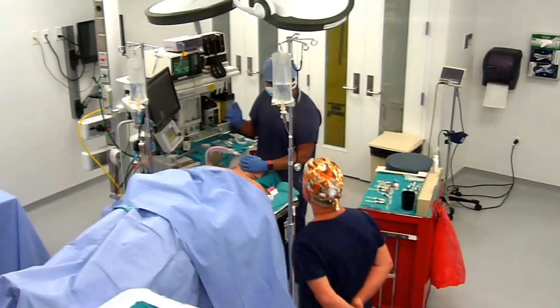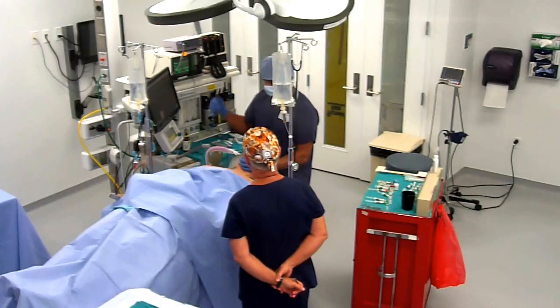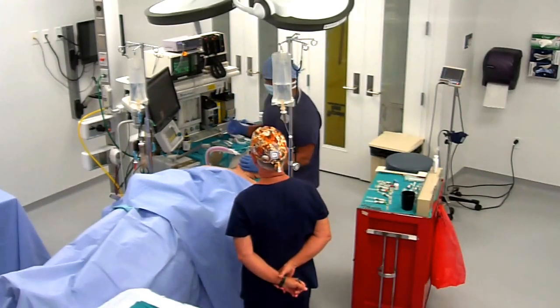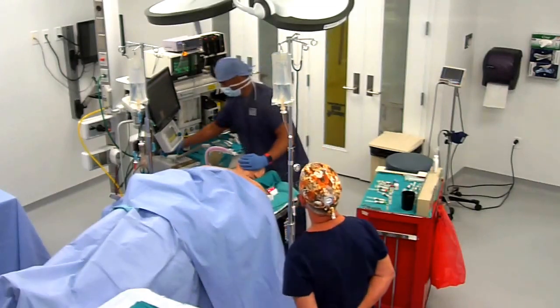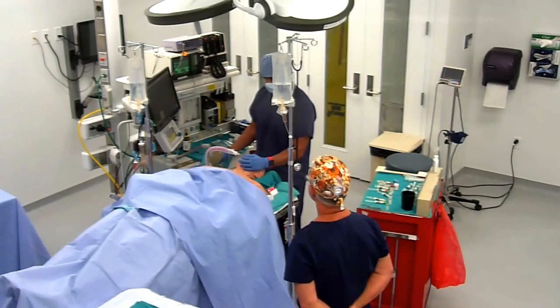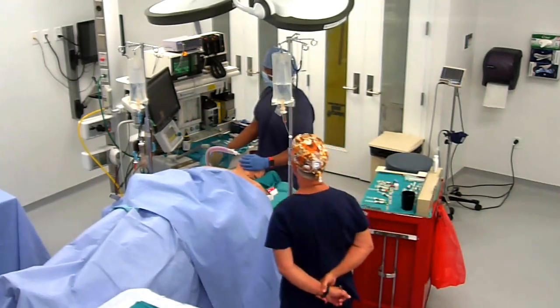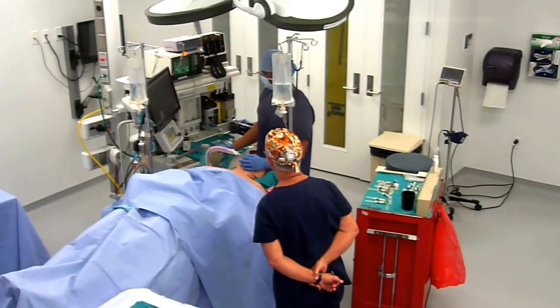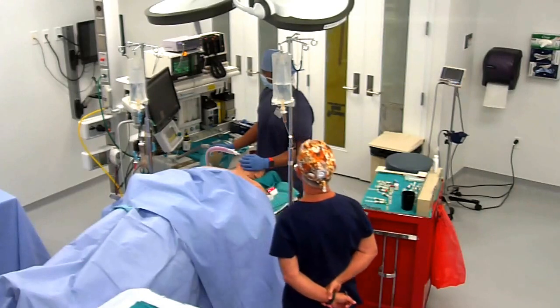So, pain medication. I gave some fentanyl. I reversed the patient. I turned off my gas. Now it's time to extubate. So, an indicator for pain is respiratory. So I want to bag the patient and go ahead and take some deep breaths for me. I want to see that they can pull some. Okay. Is he doing anything for you right now? He's not, but you're right.